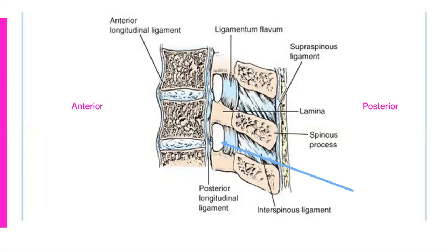Now again, onto the point of positioning. As you can see, these lumbar spinous processes are angled a bit downwards, and this is how they usually lie anatomically. By positioning the patient with their chin on their chest and the lower part of their spine, being the lumbar spine, pushed outwards and towards the operator, this lifts these up and makes them almost horizontal.